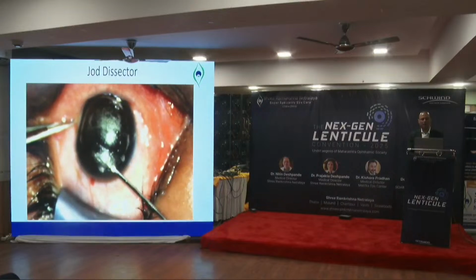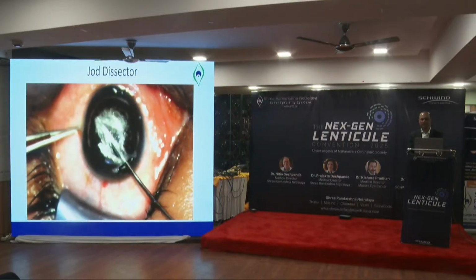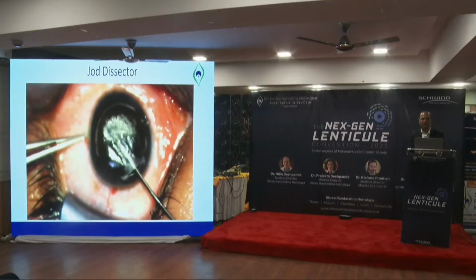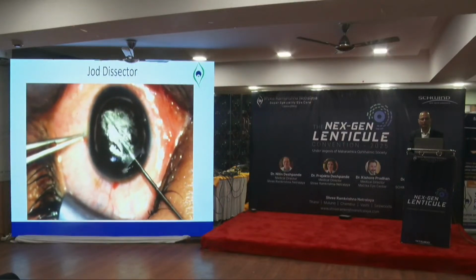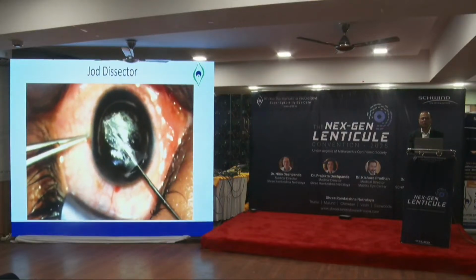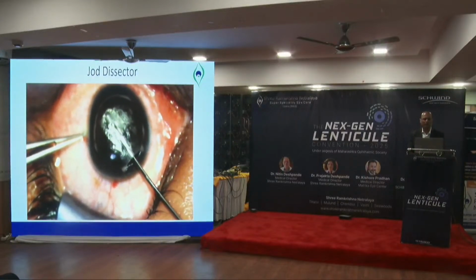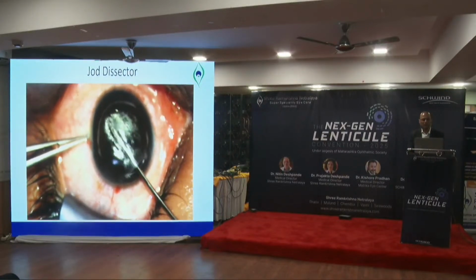And now with the edge, I'll just go and peel it. You see, I can see a little edge on that side, and I'm slowly peeling it. Again, you have to be careful here, because if you have a tear, it will be very difficult to find that little remaining lenticule, and it won't be easy.